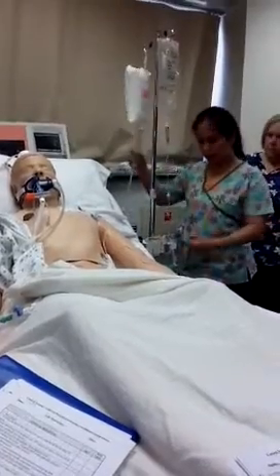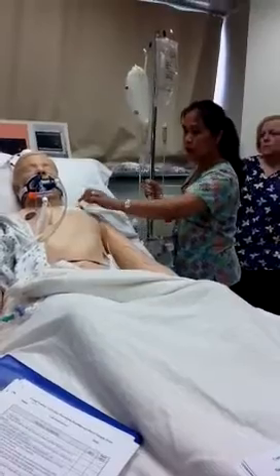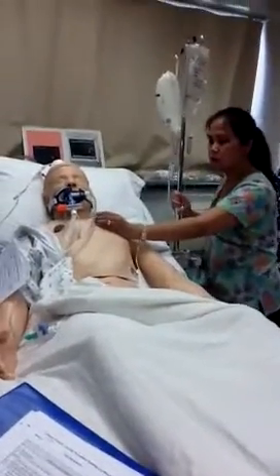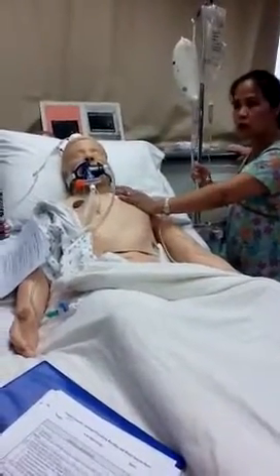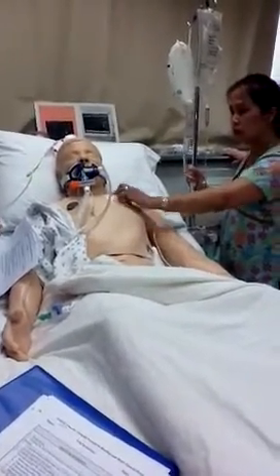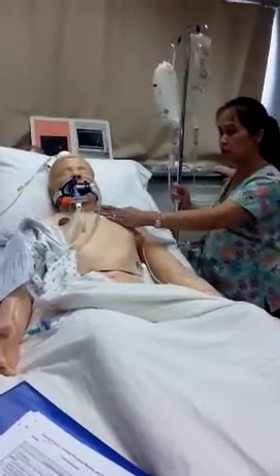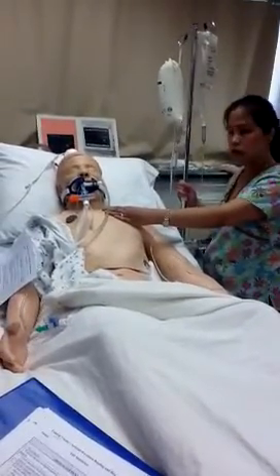Sometimes they would just use one bag and have a couple of transducers here. This one, always clamp. Make sure your site is clean. If the patient's awake, like we said, you always want to tell the patient what you're going to be doing. Assess the site. Usually it's not going to be this kind of dressing. It's going to be where you can see them, so you can see if there's any exudate there that you need to change on.